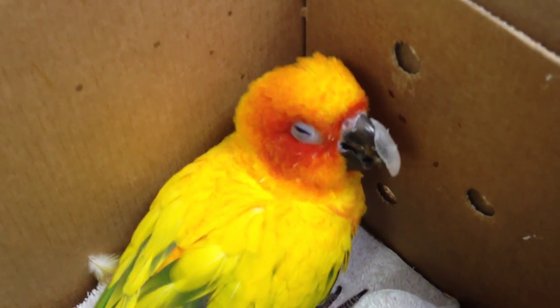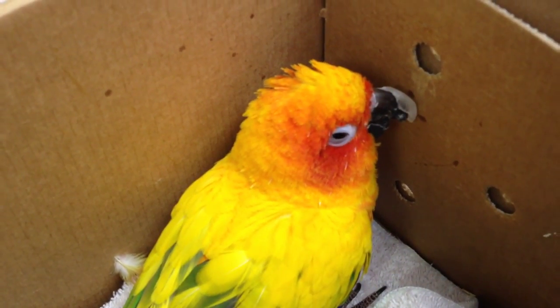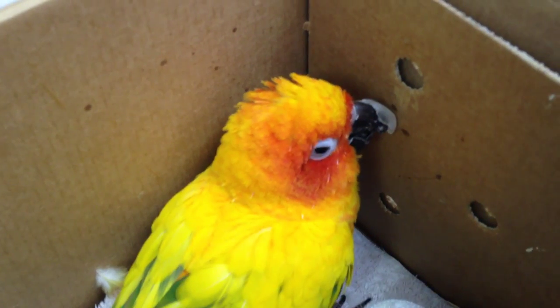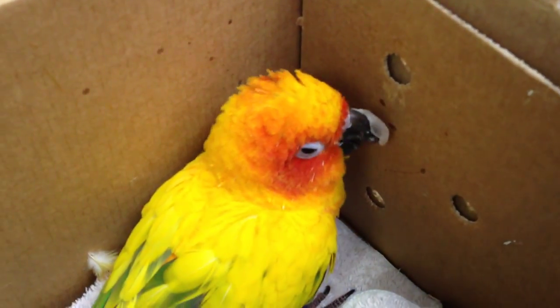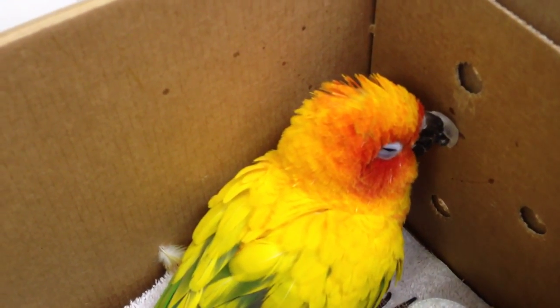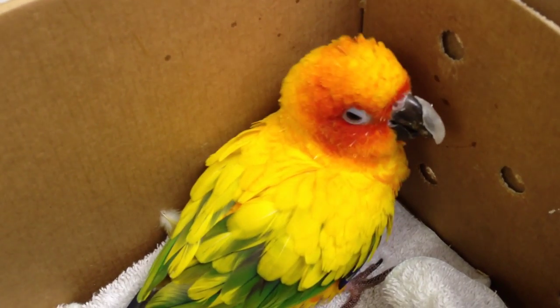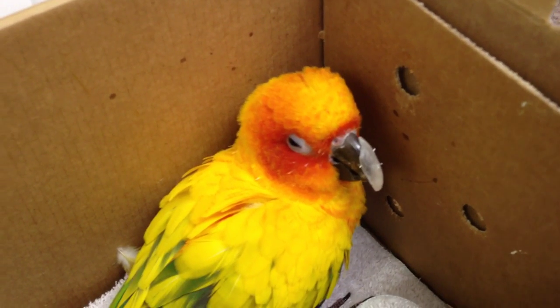This guy's been in for abnormal beak trims for most of his life. He's waking up now from anesthesia — not a happy bird. My technician has all kinds of bite marks on her. That looks like a much better fit than before, and hopefully this time it will stay on.